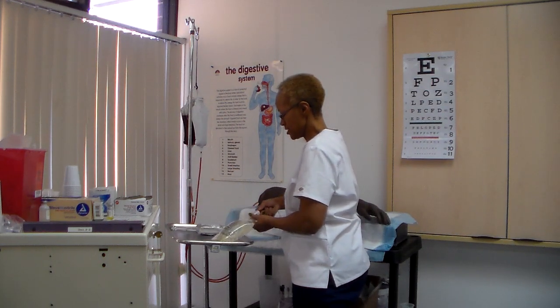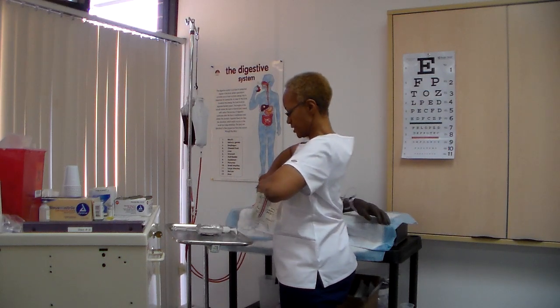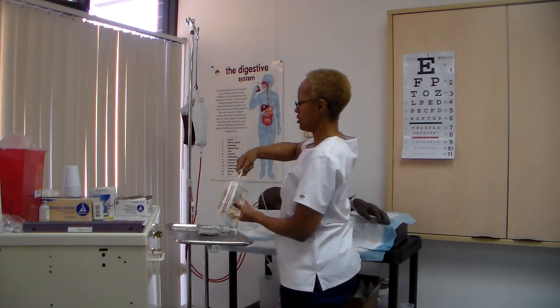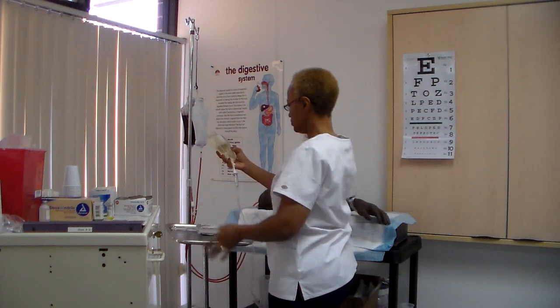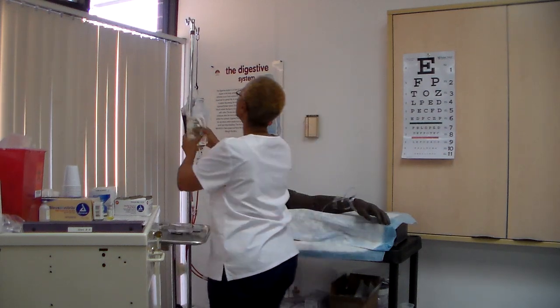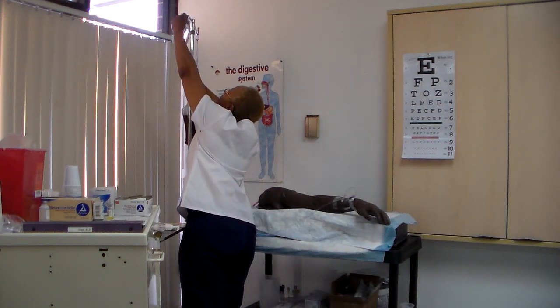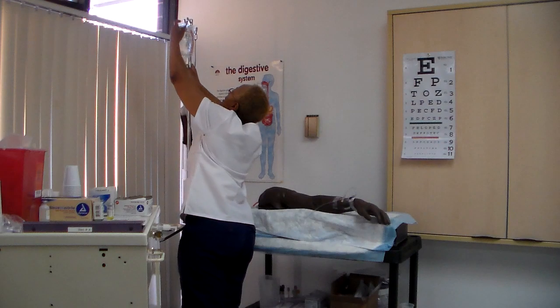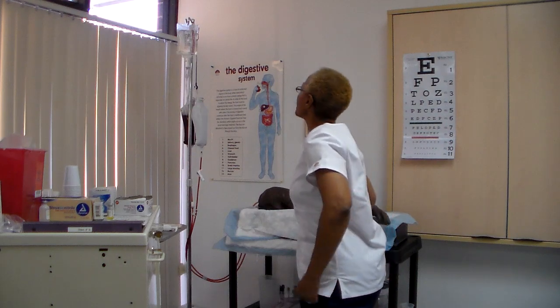Insert it all the way in. Doesn't drip, and it has like a little line that you have to make sure that you insert it to. Okay, great. I'm gonna have to lower this for you guys because I know I'm tall and most of you probably can't reach that. Okay, here we go.